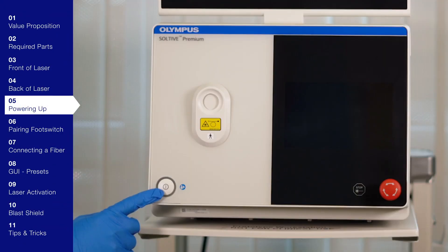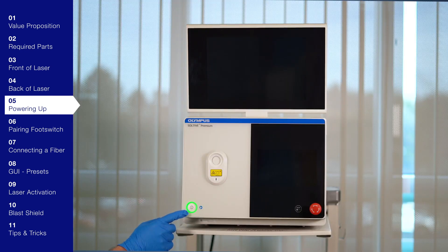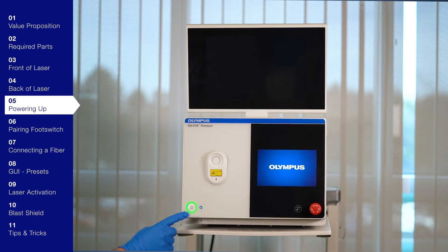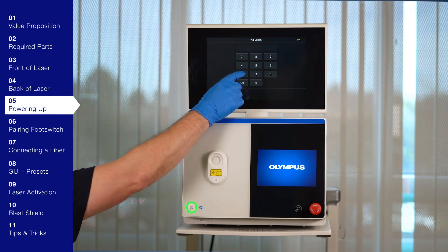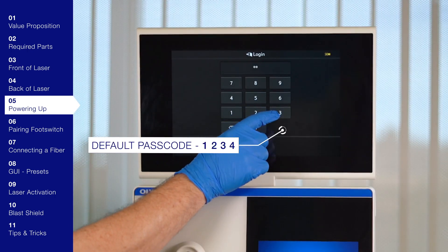To turn the laser on, press the power button on the front panel. When pressed, the LED lights up to indicate the laser system is turned on. The initial screen will present the company logo, followed by the login screen. Then enter the default passcode of 1234.